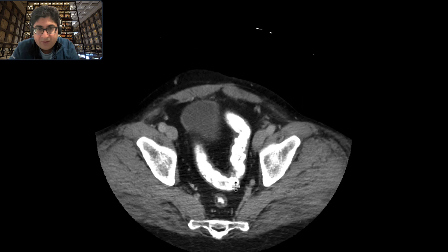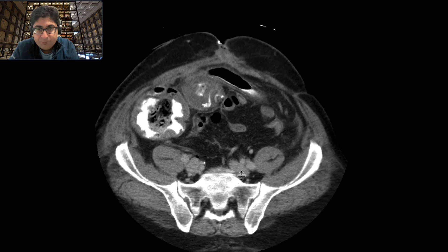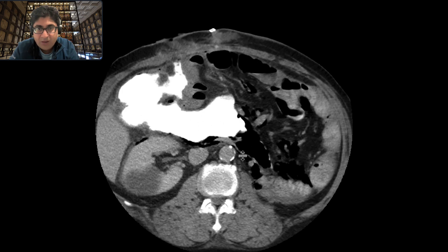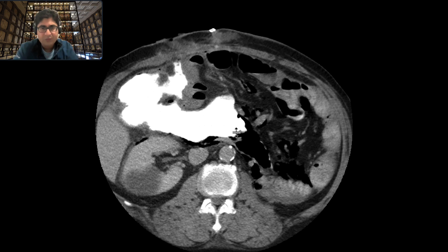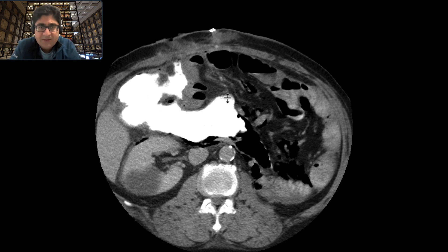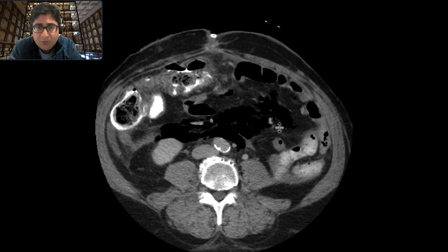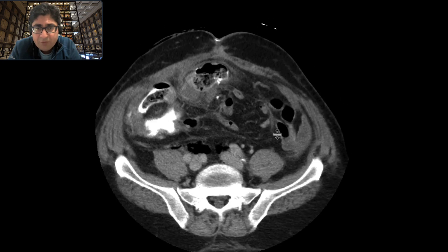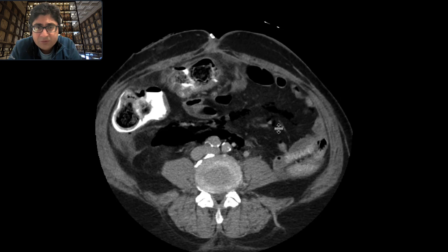you're able to catch this large blob of oral contrast that's sort of lying anterior to the left kidney, adjacent to several loops of bowel, and not really conforming to the shape of any bowel.